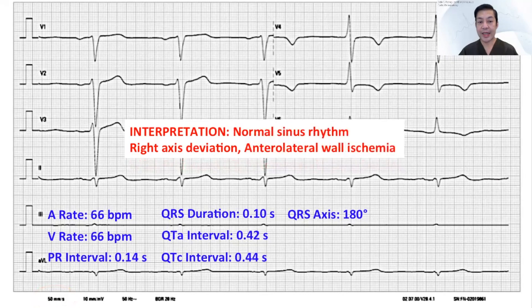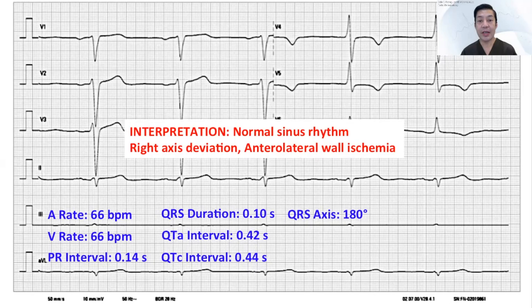So that will make our rate 66 beats per minute, both in the atria and the ventricles. The PR interval is now normal at 0.14 seconds. The QRS duration is 0.10. The QTa is 0.42, corrected at 0.44, still with the axis at 180 degrees. So with that realization, we now change our interpretation to normal sinus rhythm, right axis deviation, and anterolateral wall ischemia.